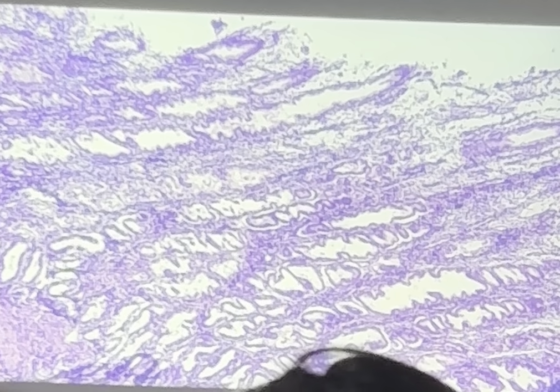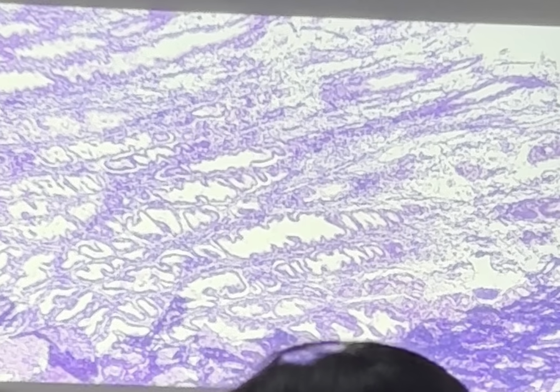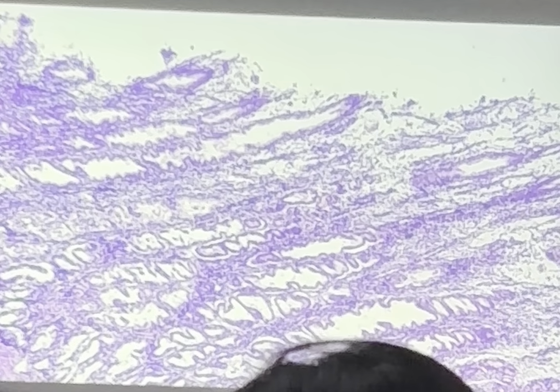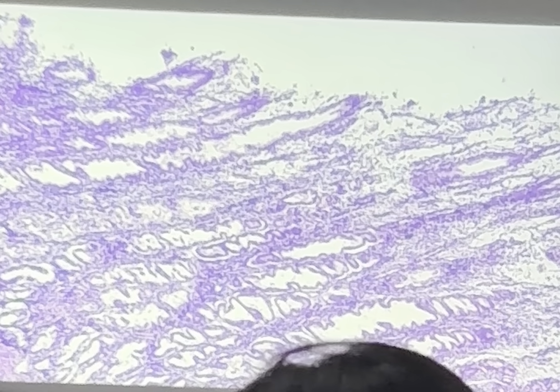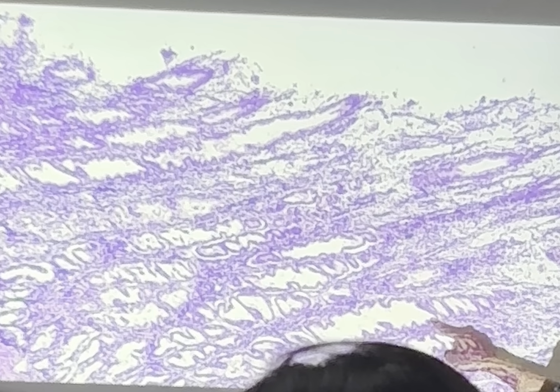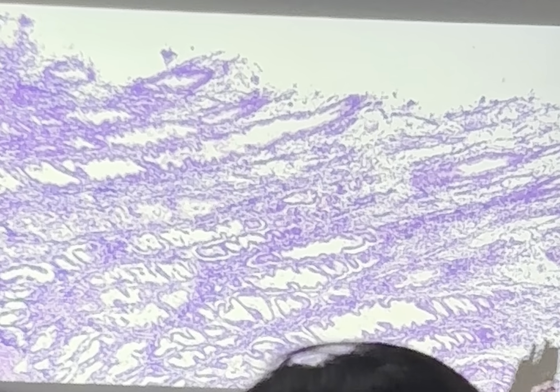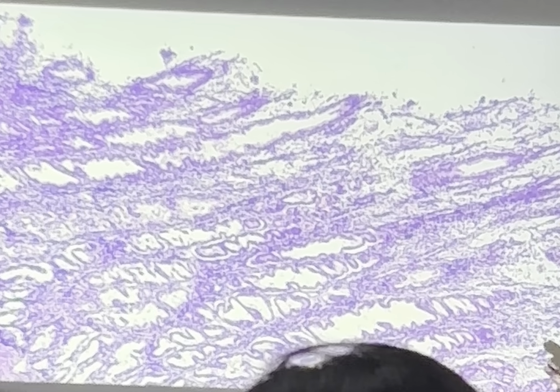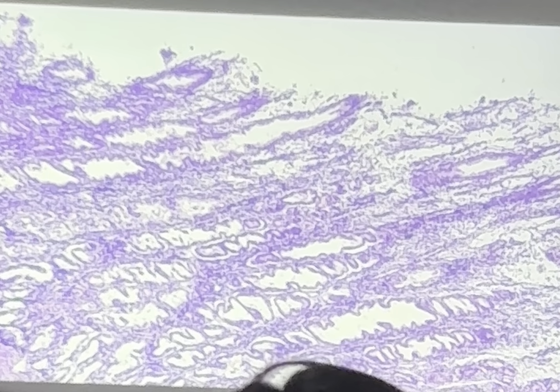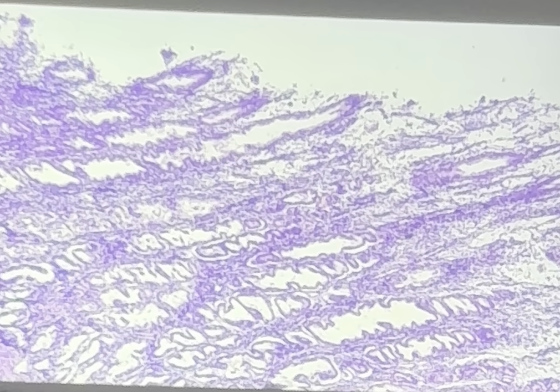What can you say about this endometrium? Is it benign or malignant? Are they going in really random directions, or are they more or less going in the same direction? Same direction. But now we see the very classic sawtooth arrangement. And the glands are actually relatively uniform. They're all going this way. Do we see gland within gland? No. We don't really see outpouching. Okay? This is secretory phase. This is now your real secretory phase.